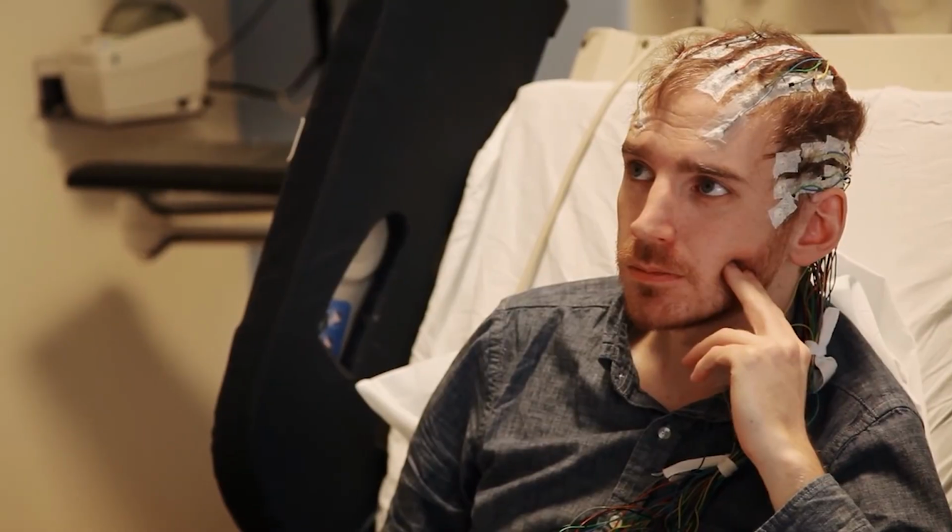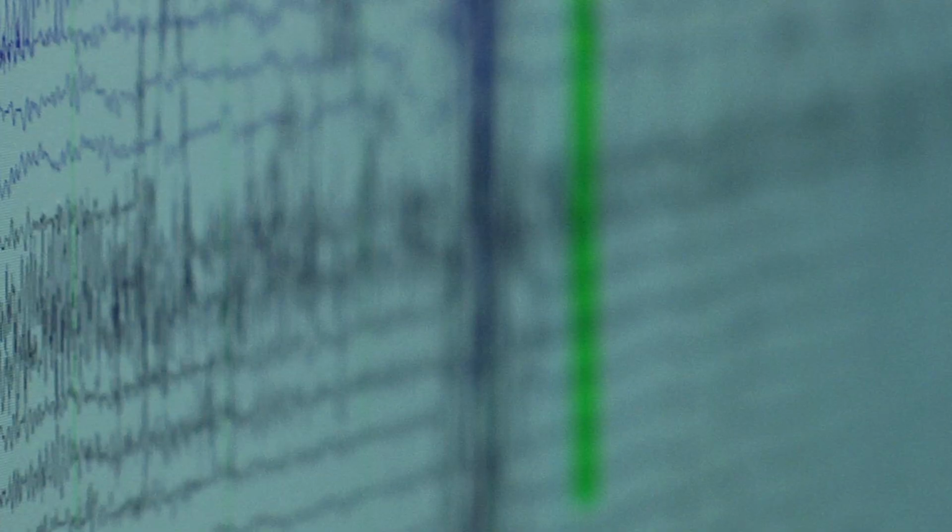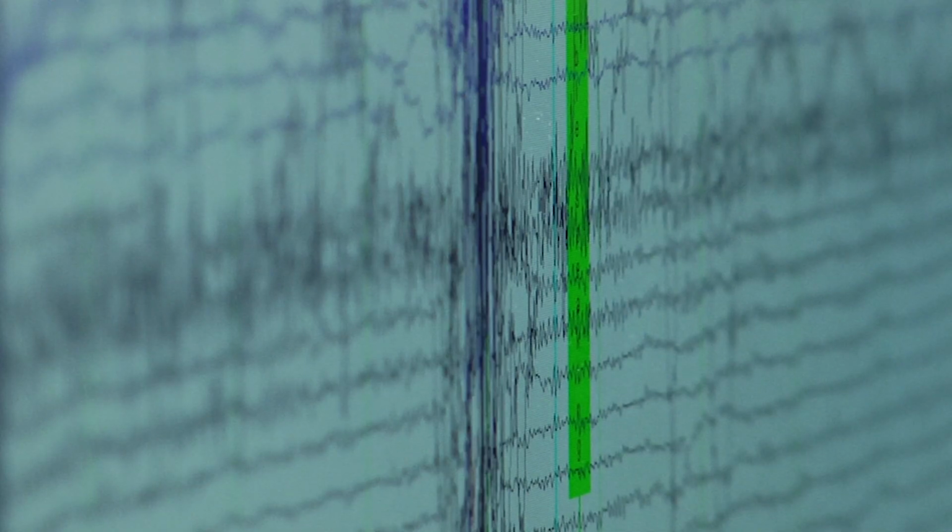When patients come to the Epilepsy Monitoring Unit and have electrodes placed on their head, we ask them, if they feel that a seizure is coming on, to push a seizure button. This button indicates on the record, on their recording of their EEG, that the patient feels something that is like their seizure episode, and that allows our EEG fellow, our attending physician, to look at the record and very closely scrutinize it to identify electrical activity from the brain that could suggest where a seizure is coming from, what type of seizure the patient is having.